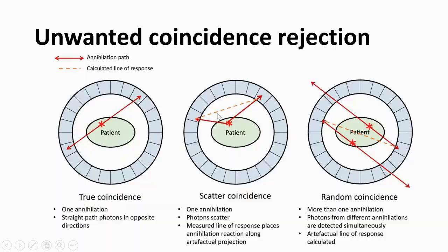What happened in the place is that it tells you, yes, this is the place where a gamma photon was detected in this crystal. The second gamma photon did not get detected. It crossed from the opposite crystal for some reason. In the opposite direction of this crystal, there is another crystal, or another point, or another radioactive material located on the different side of the partition, which will also emit a gamma photon. So these 2 opposite detectors detected them at the same time.